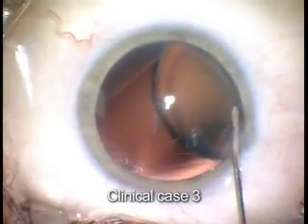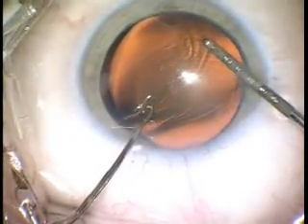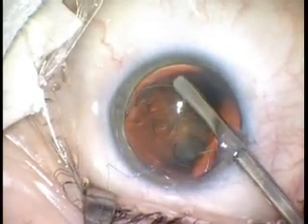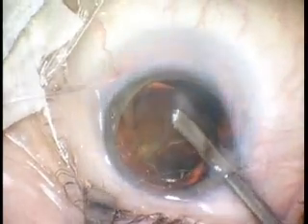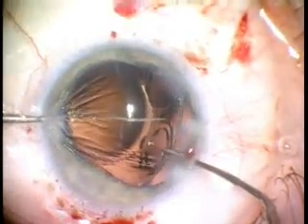In this patient, the lens was so loose that it had to be stabilized with the hook during the capsulorrhexis. The ring was implanted into the capsular bag prior to performing phaco, stabilizing the lens for emulsification. After removal of the crystalline lens material, the intraocular lens is implanted.